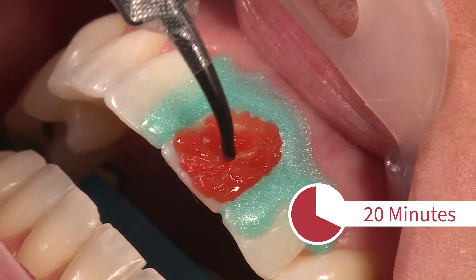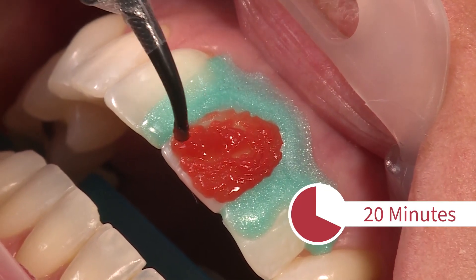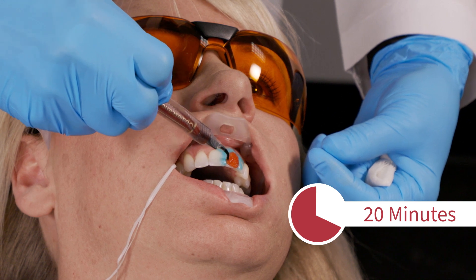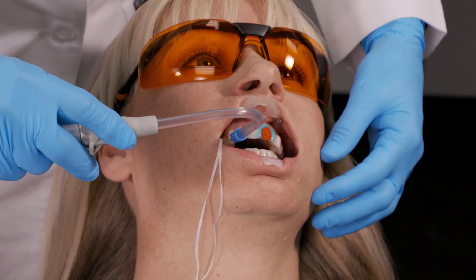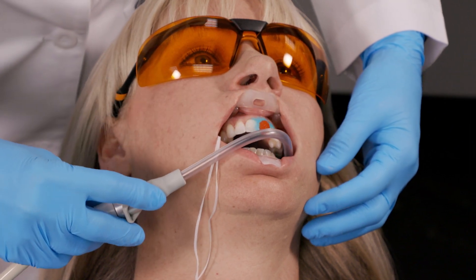Allow the gel to remain on the teeth for 20 minutes, checking and reapplying the gel to areas that have thinned or need replenishing. Periodically suction saliva with a saliva ejector as needed.